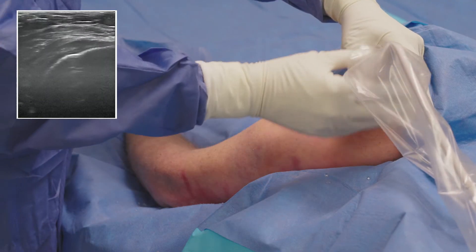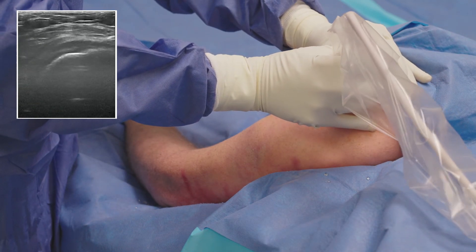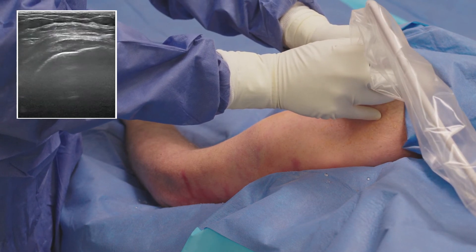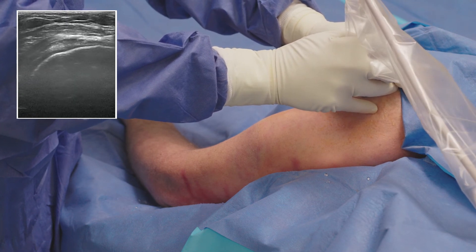After three to five minutes of debridement with TenJet, I scan the tendon again to confirm that I have reached all of the diseased pain-inducing tissue. Looking at the ultrasound, I can see a very uniform appearance of the tendon with a reduction in the thickening which we saw in the tendon previously.